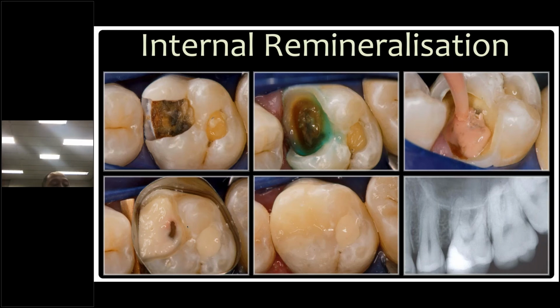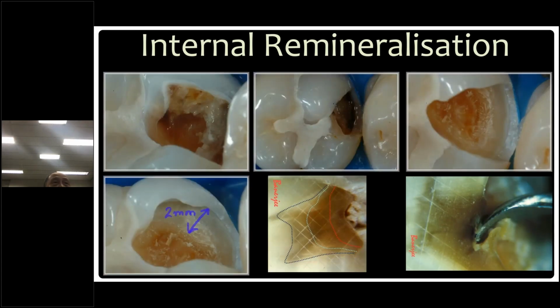So this is so important. I want to once again summarize this for you. This lesion is different because it's entirely in enamel margin. We have that clean border by using a reduced handpiece, a number two or three round burr, to go right around under the enamel, right around the entire cavity.